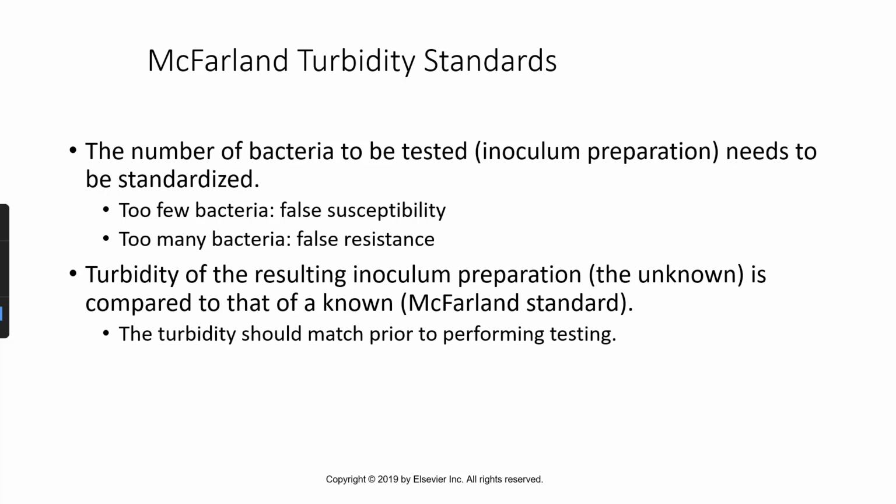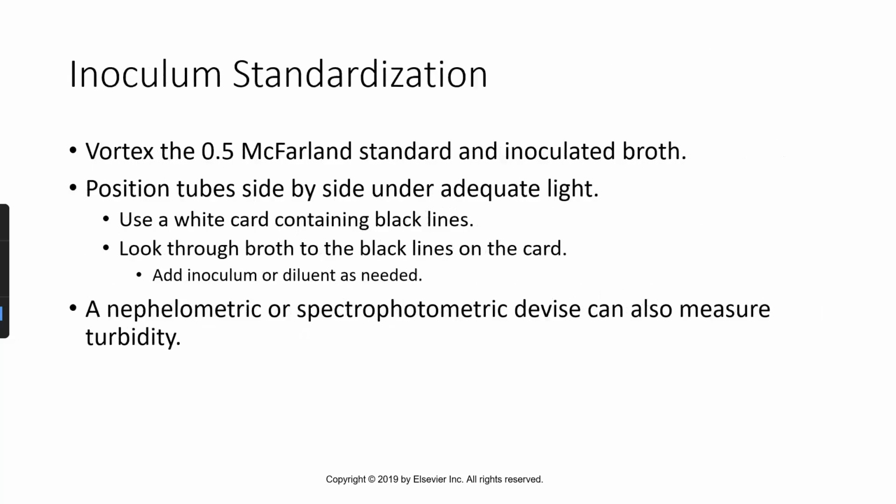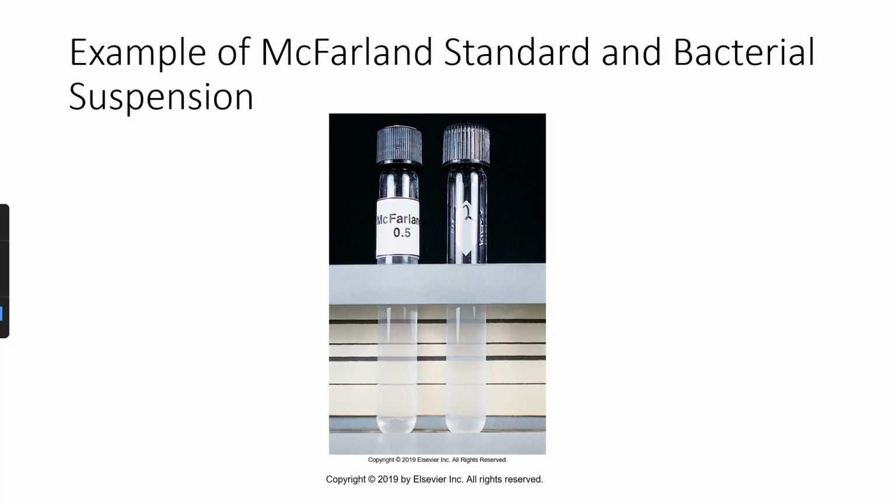Turbidity of the resulting inoculum preparation is compared to that of a known McFarland standard. The turbidity should match prior to performing testing. So I just want to show you, this is a McFarland standard here, and you can see the black line through it. And here is our test sample. You can see that this test sample is too cloudy, so we would have to dilute that until the cloudiness matches this.